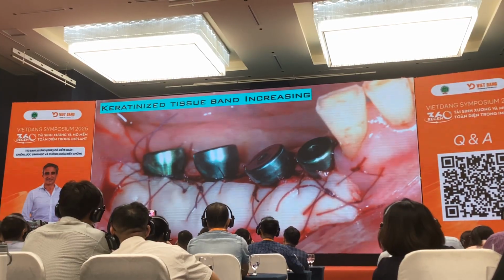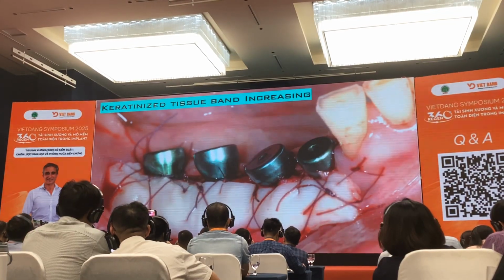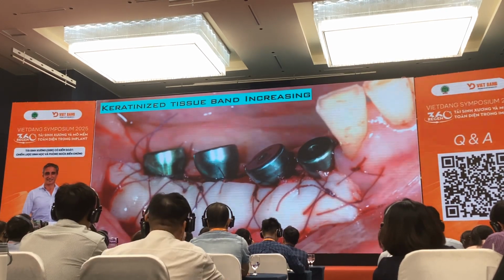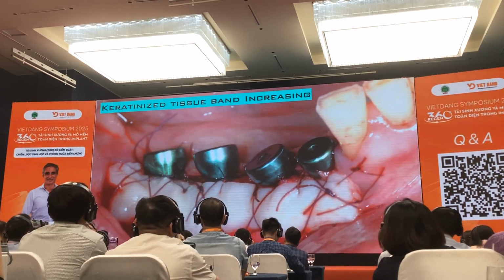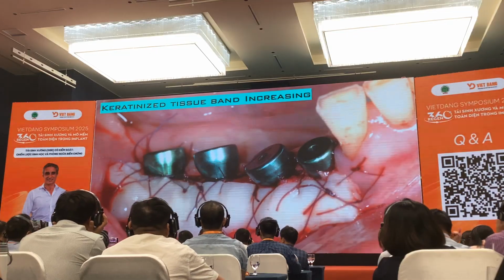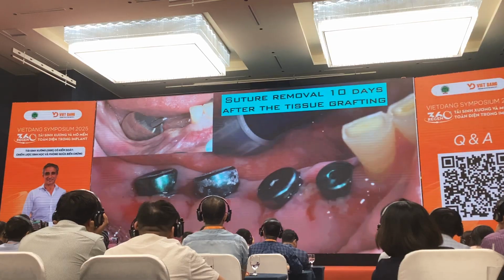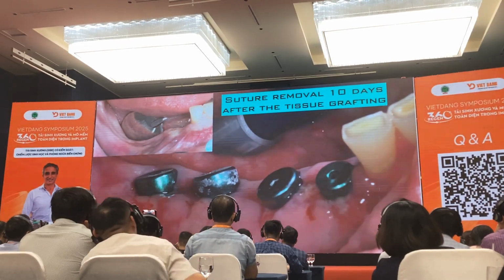If we push the graft against the vascular bed, we help the revascularization of the graft in a short time, without the interposition of a hematoma.